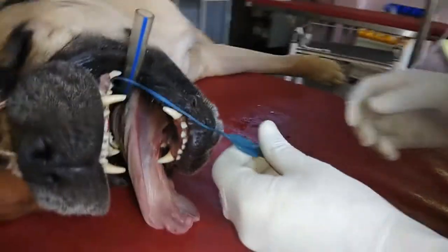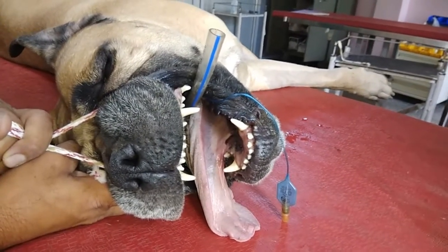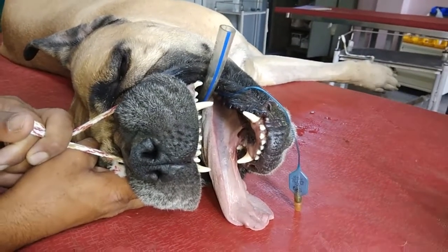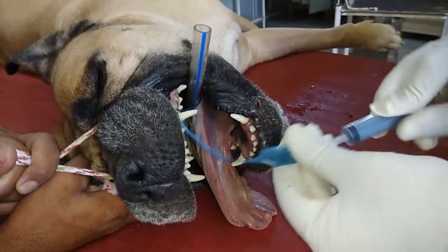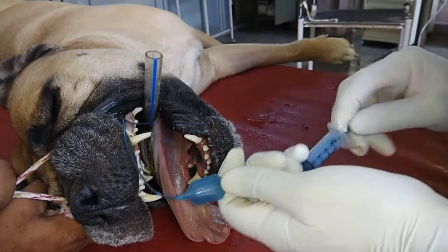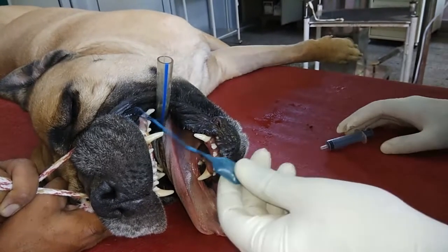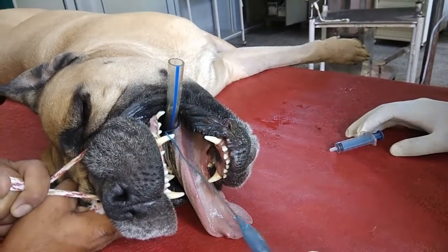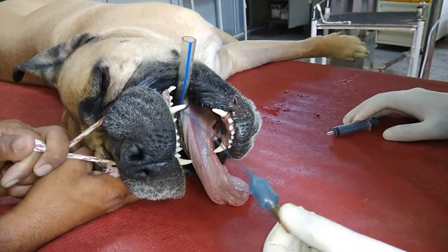Then inflate the cuff with 10 to 15 ml of air. This is very important because if you do not inflate the balloon, any tracheal secretions will go into the trachea, ultimately reaching the lungs and potentially causing bronchitis or pulmonary disease.